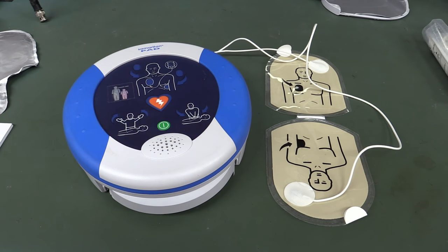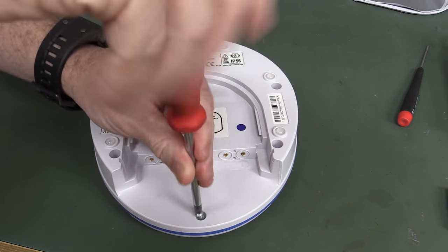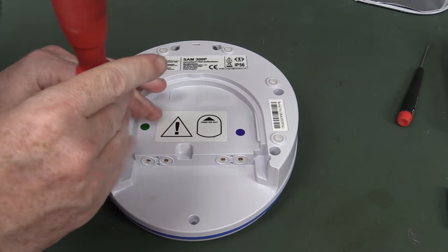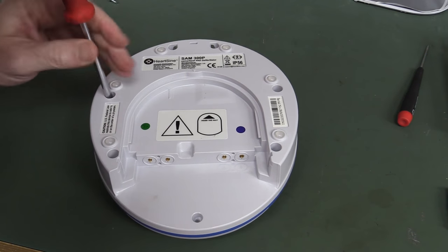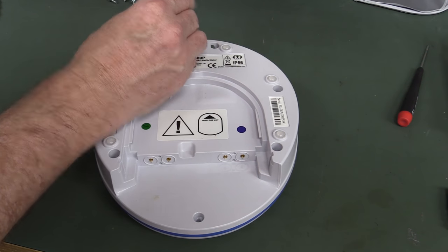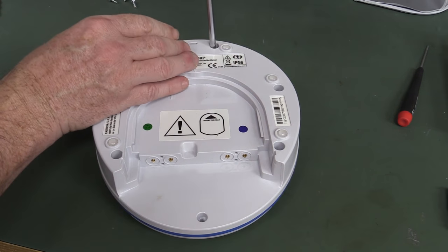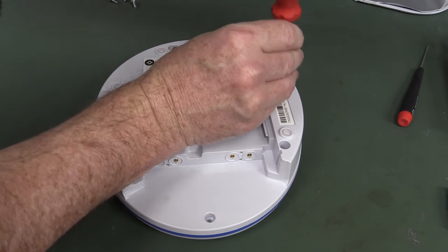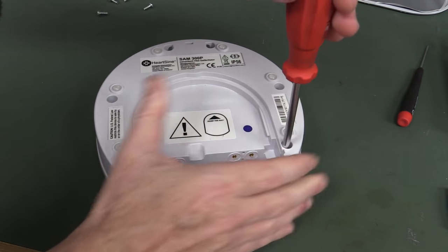You know what we say here on the EEVblog: don't turn it on, take it apart! Now you certainly wouldn't go taking one of these apart if it was powered up or if you've powered it up recently, because we're going to see a big capacitor bank in here which stores the high energy pulse — up to 200 joules for an adult and 50 joules for a child. I don't know whether or not they control the energy from one capacitor bank or maybe they have two — not entirely sure, we'll find out.